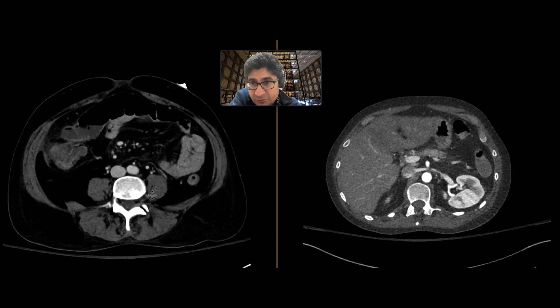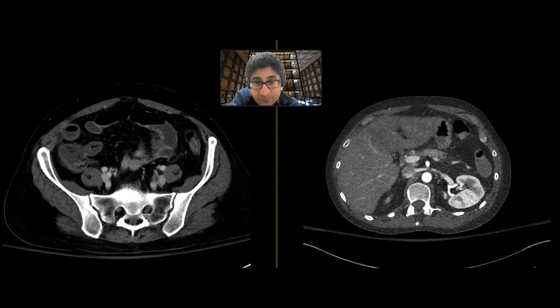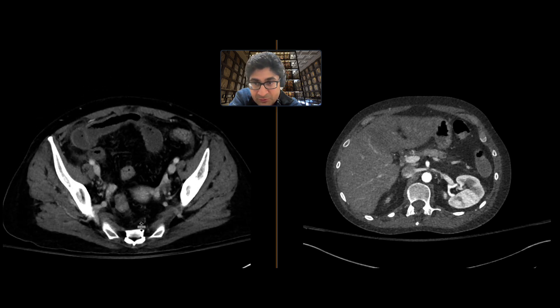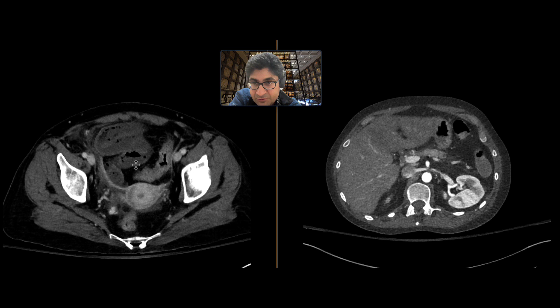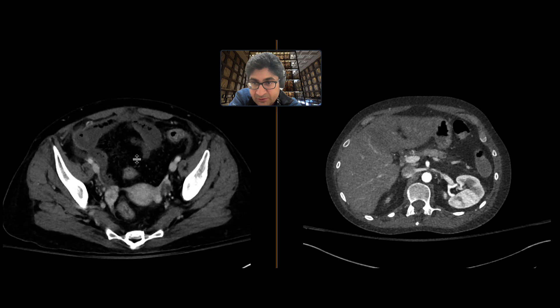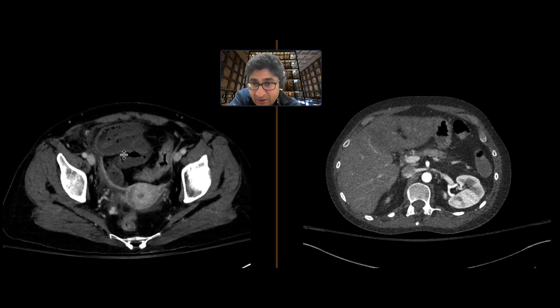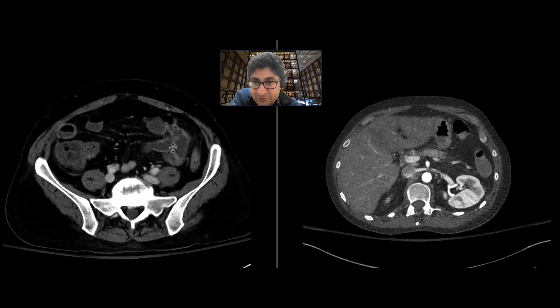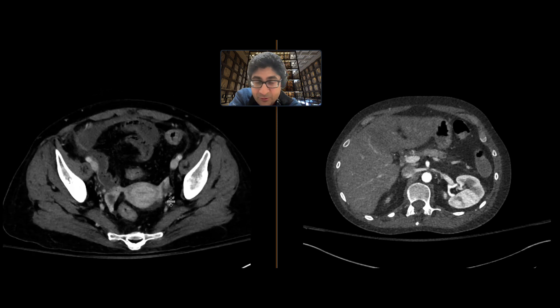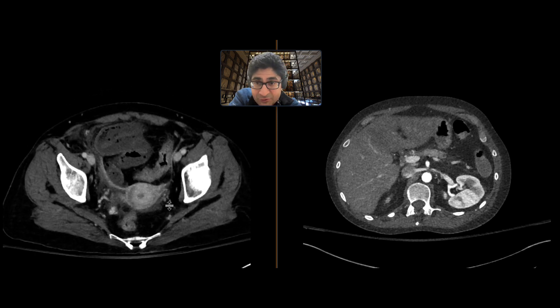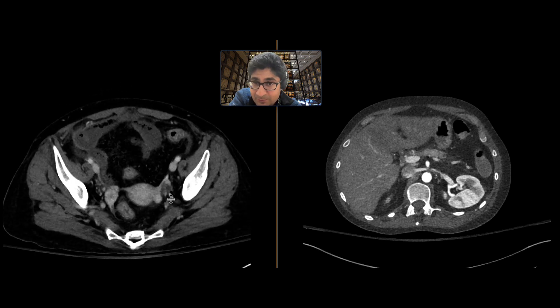The final finding for this patient — as we scroll downward, the bowel doesn't look too happy. Look at the distal bowel here. There's clearly not a lot of enhancement within the wall. Comparing it to more proximal loops of bowel where the wall is enhancing within normal limits, this is highly concerning for ischemic bowel.